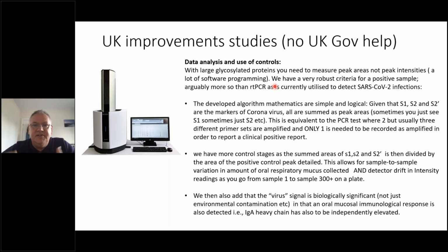Of course, because we were reducing everything, if we did not see these mucus-associated proteins, then we knew that we were not getting a very good sample. But it also enabled us to do some other things as well. That gave us a little bit of a handle on quantification.